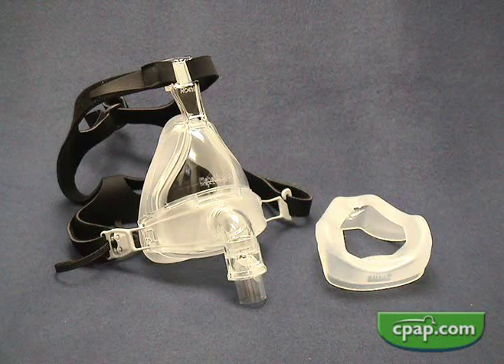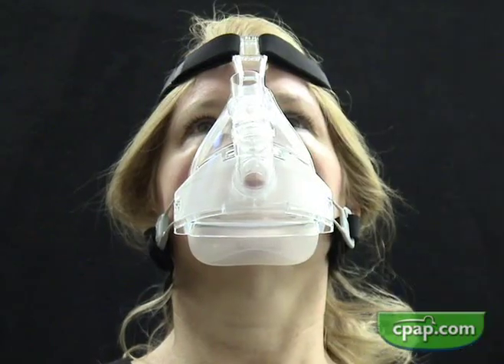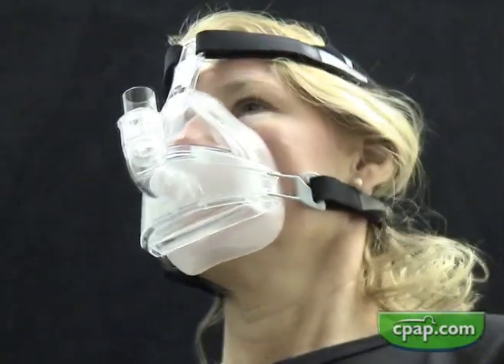The Fisher & Paykel HC-431 Full Face Mask is an appropriate mask to use when nasal breathing is not practical. The mask features an under-the-chin design, mask stability is enhanced, and seal is improved, even with jaw movement.